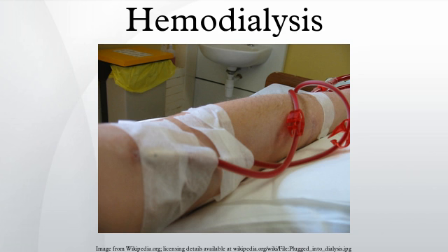Dialyzer. The dialyzer is the piece of equipment that actually filters the blood. Almost all dialyzers in use today are of the hollow fiber variety. A cylindrical bundle of hollow fibers, whose walls are composed of semi-permeable membrane, is anchored at each end into potting compound. This assembly is then put into a clear plastic cylindrical shell with 4 openings. One opening or blood port at each end of the cylinder communicates with each end of the bundle of hollow fibers.